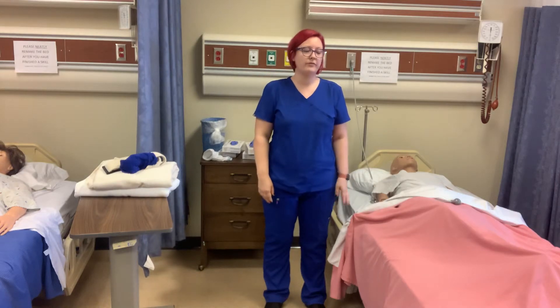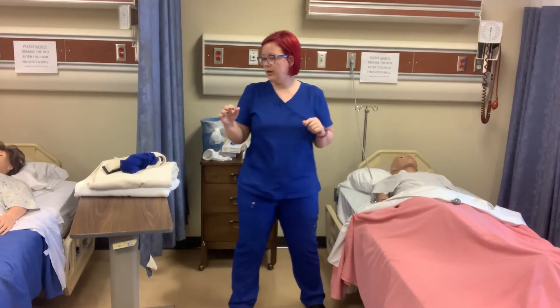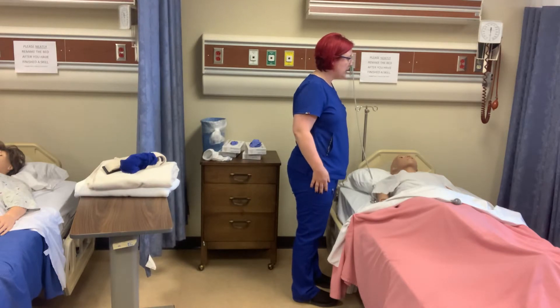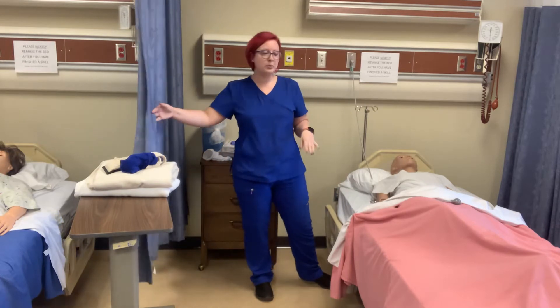This skill is transferring a resident from the bed to a wheelchair, so we're going to go ahead and start with knocking. Hi Mr. Jones, my name is Reva. I'll be your nurse aide today and I'm going to get you up out of bed and into the wheelchair. I'm going to wash my hands and we're going to provide for privacy.